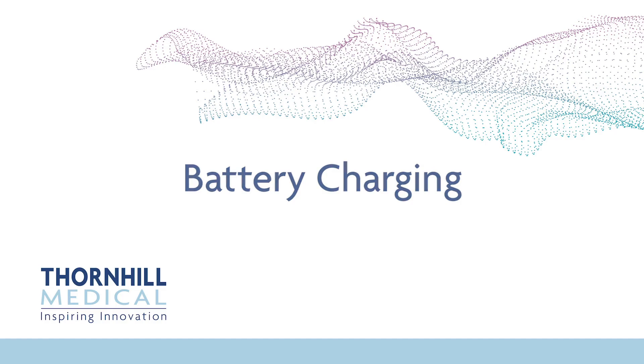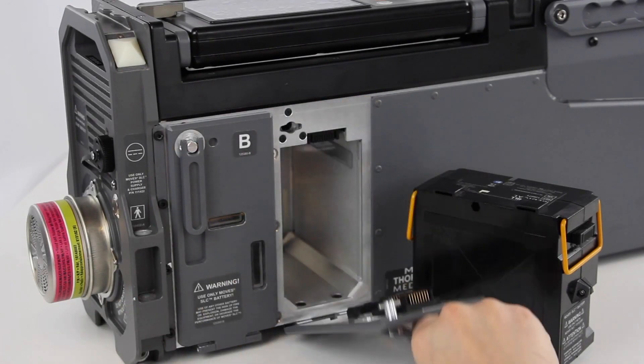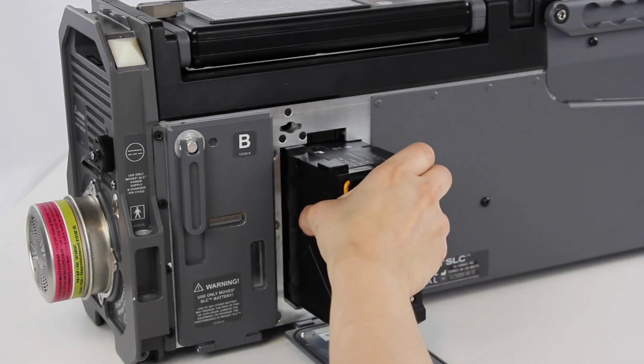Battery Charging. If the system is not in use, MOVES SLC's batteries should be charged at least every six months. If not already installed, remove the batteries from the accessory case and install them in the device.